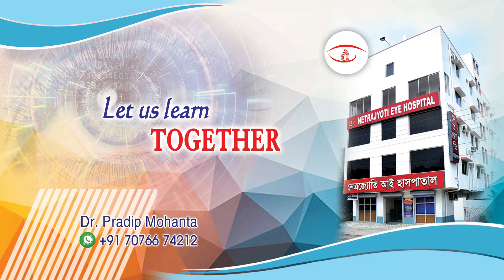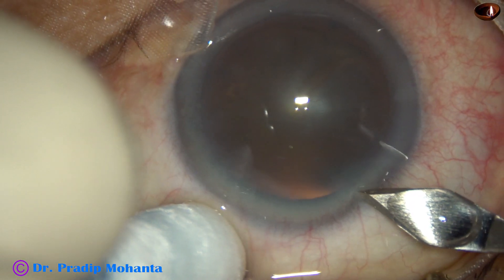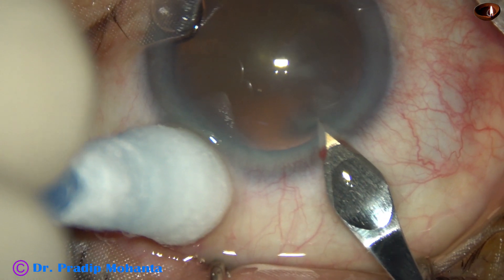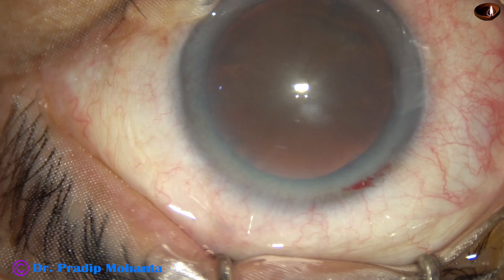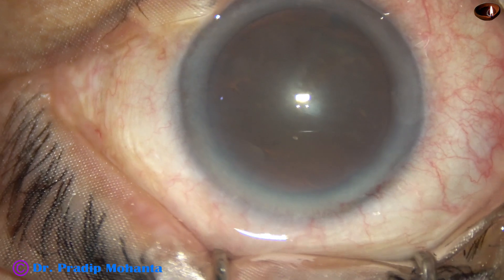Friends, welcome to my workplace at Ranaghat, West Bengal, India. This is a routine phacosurgery and I didn't expect any problem in this case. This is the main incision at mid-limbus with a 2.8 millimeter steel keratome. There is a little bit of oozing of blood from the lips of the wound.